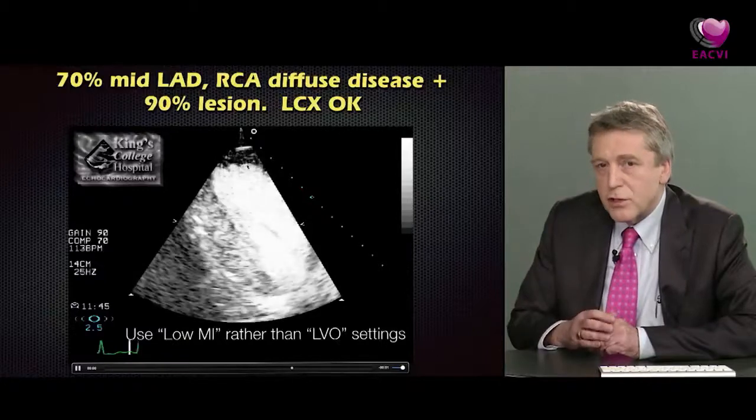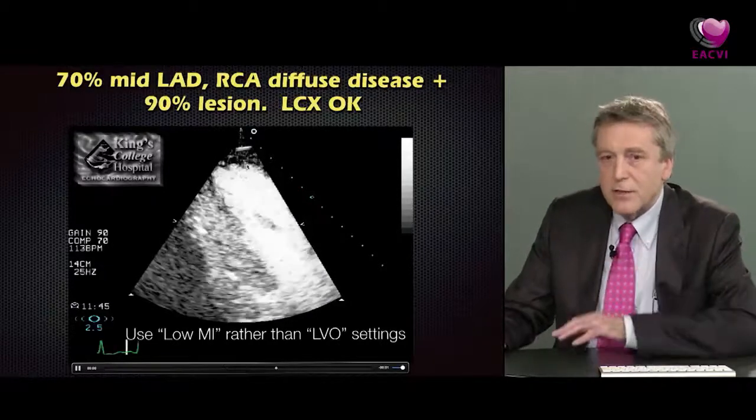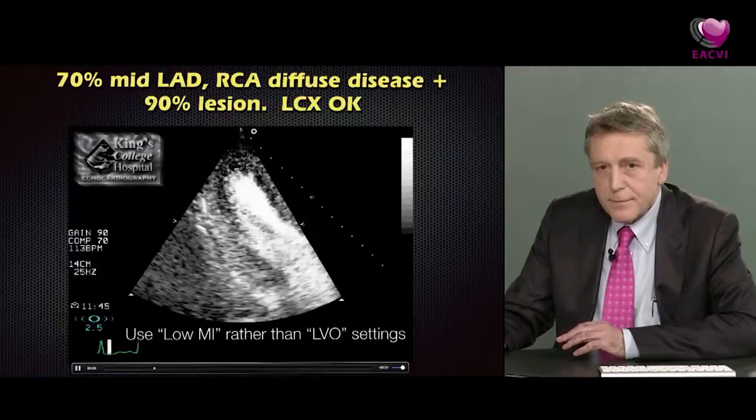But the point here is to show you that you can pick up the perfusion defects at a lower stage than the wall motion abnormalities.